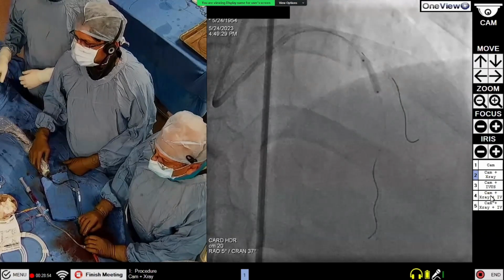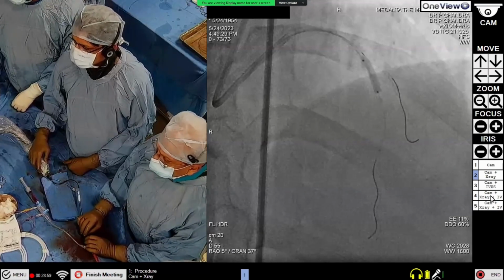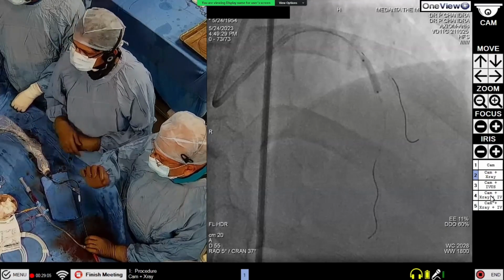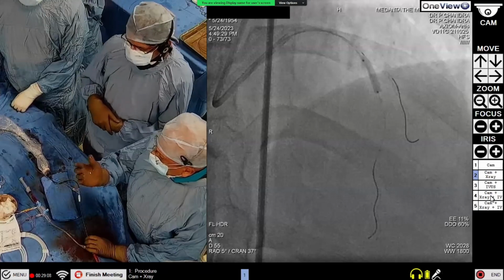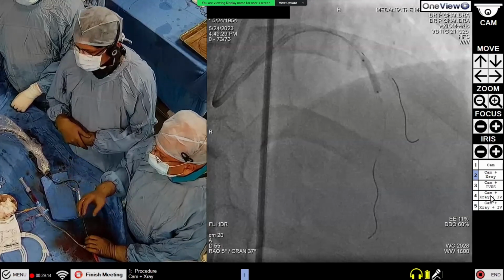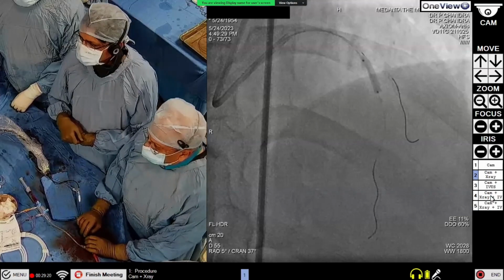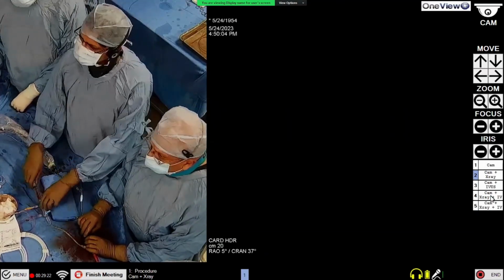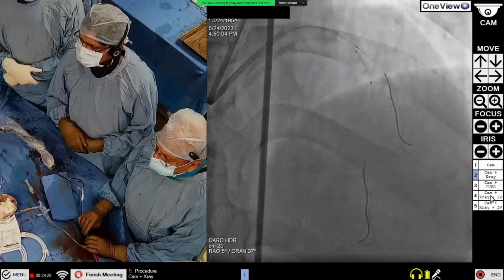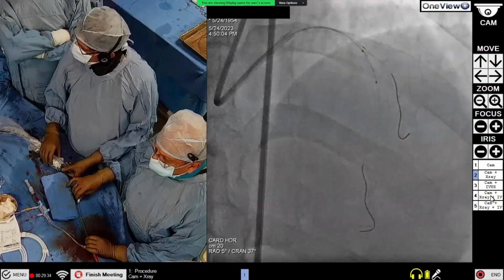There is still one point where the calcium is still visible. Give all of them. If you can even move the balloon, because I must tell you one thing, these emitters are actually emitting in one dimension only. So there may be a different area at 90 degrees to those emitters that will not get that much energy. So if you move it a little bit, if it is possible, it might help. Okay, deflate. I am going to move it a little bit. Yeah, it's looking good. I will try to rotate it. That's fine. Go up again.